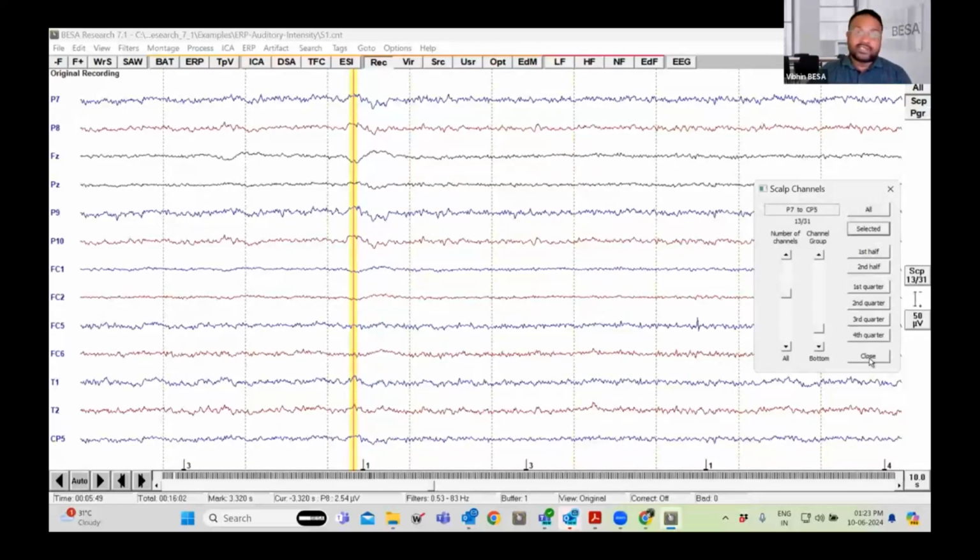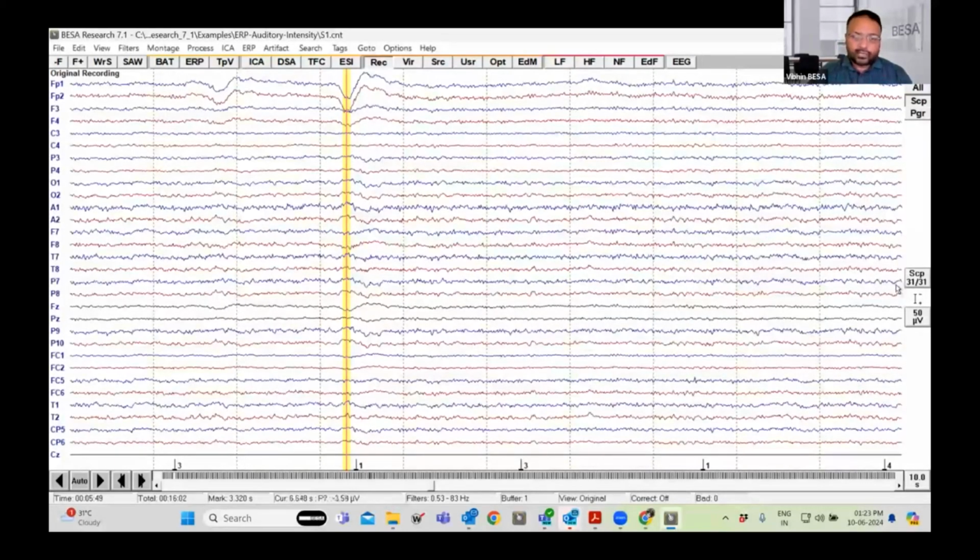Of course, in this case, it is not that useful because we already have a limited number of channels. We have only 31 channels, including the reference. But this will be very useful when you are using high density EEG data, or when you want to analyze magnetoencephalography data, which has 306 channels, or else 250. I don't know the other number. It should typically be 306.